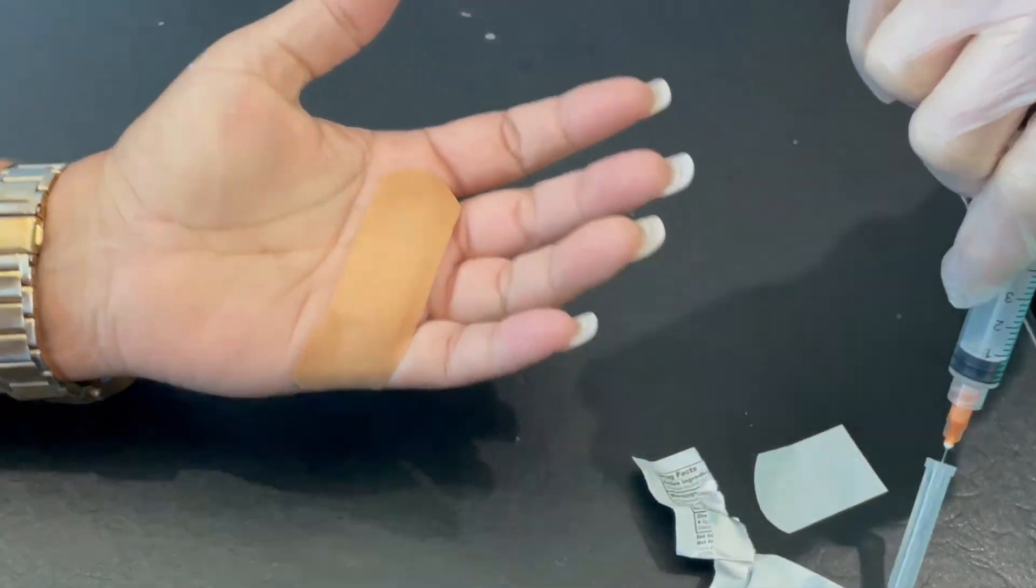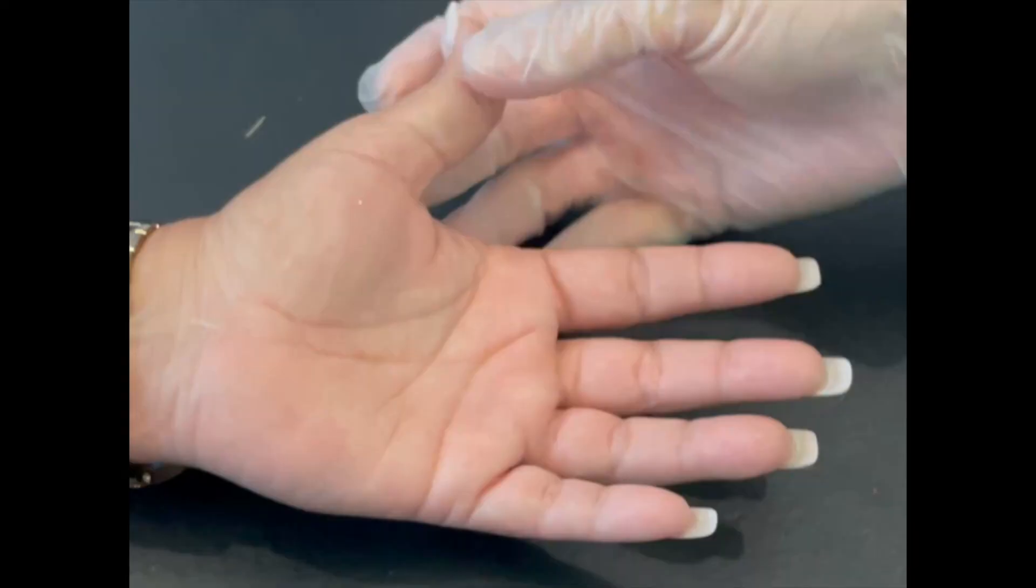The other tip for this injection is that you don't have to go very deep. You do not actually have to hit the tendon - you just have to be in the subcutaneous area to have a good result for your patient.